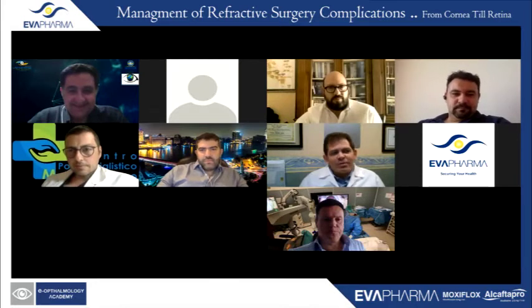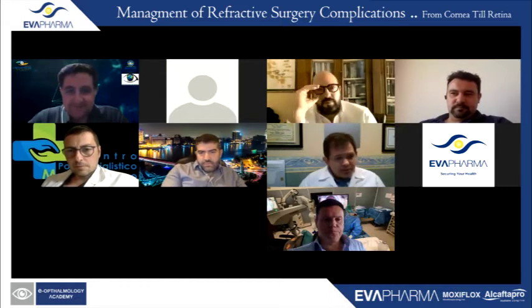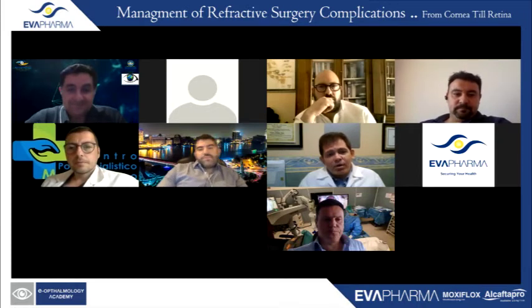So everything is normal, but I have just done a topography and a central corneal thickness. So you have done 2 exams, which are very important. I remember when I did my training in the late 90s, we were debating if topography was essential for every refractive surgeon. I did a survey in a meeting in Brazil, and 25% of people did not do topography in every case. Even some of them had a topography at their clinics.